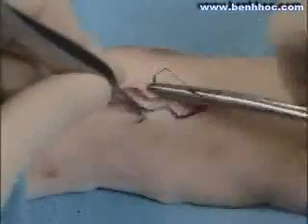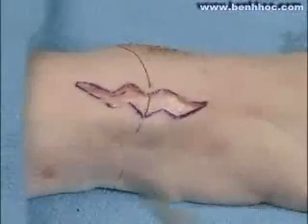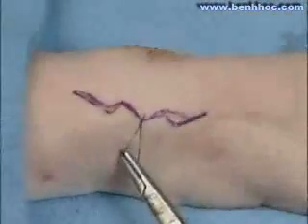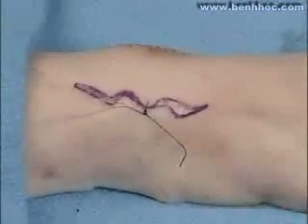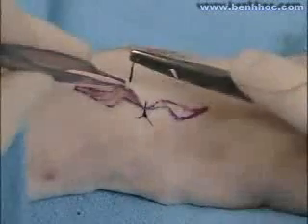Deep sutures may be placed when necessary, and it's usually best to use deep sutures with a long-lasting life so that they are in position for a long time. Then eventually they may dissolve. This will allow the deeper tissues to be closed and keep the tension off the skin sutures.